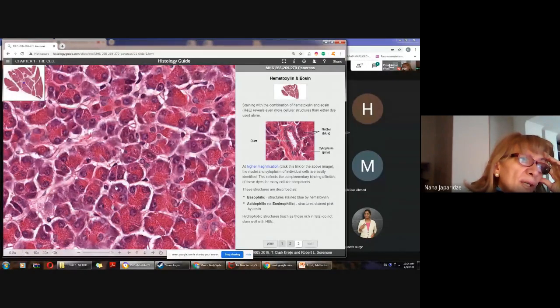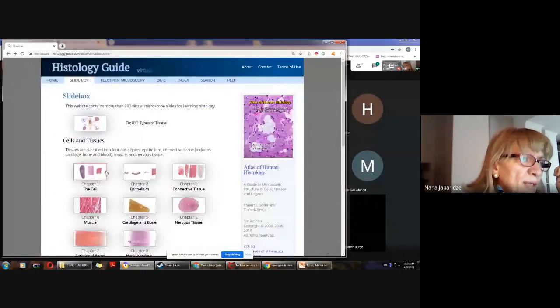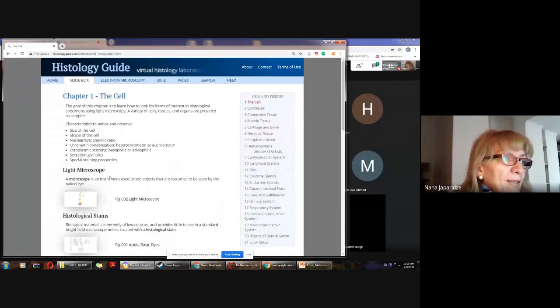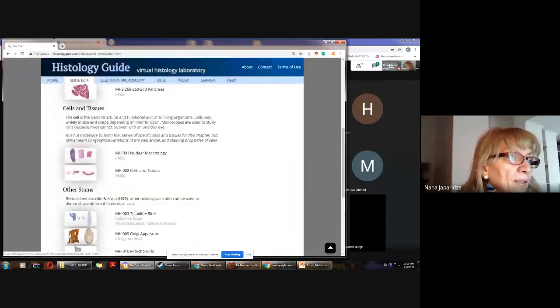So you see here the nucleus and the cytoplasm which surrounds it. I will show you other tissue samples, where we have to be able to identify the cell nucleus and the cells themselves. Look.